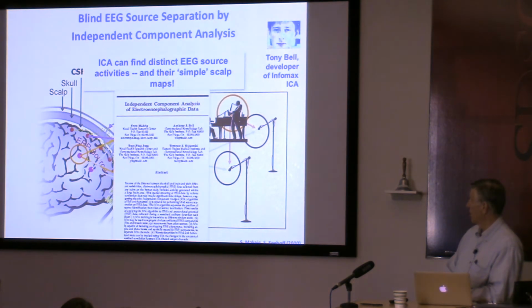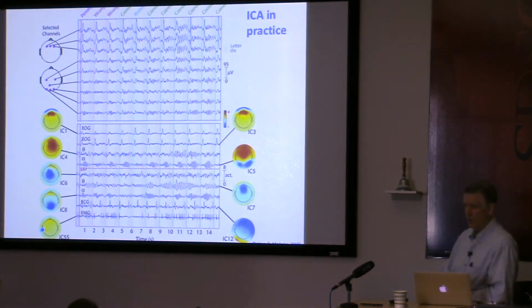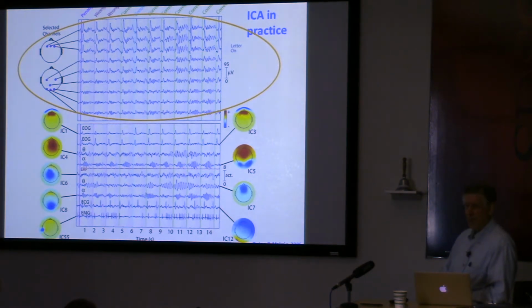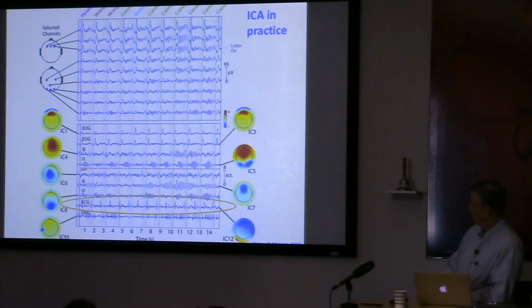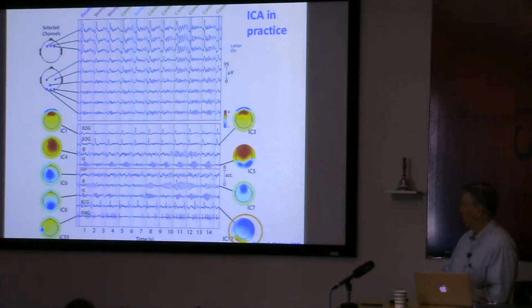So we're going to talk more about it, and I showed this. Let's go through it with perhaps a few different comments this time. Remember, we decomposed using what would be extended infomax ICA. We decomposed half-hour data from 100 channels. We got a half hour of 100 independent component processes, and we show a subset of those here for illustration purposes. We got a perfectly formed ECG, which could have perturbations if there were such. It would be sensitive to those.